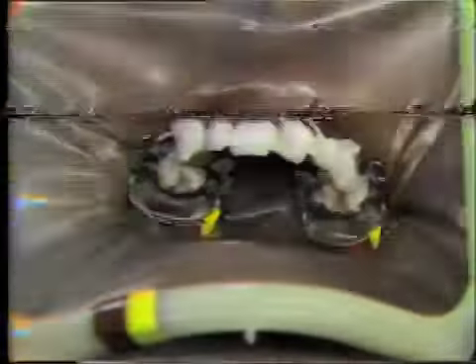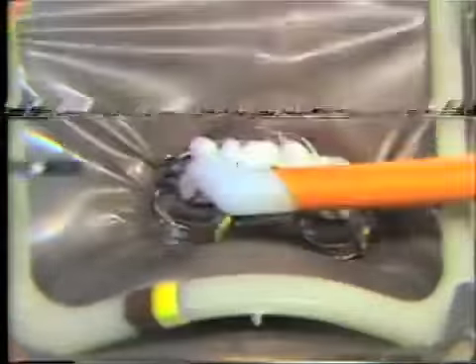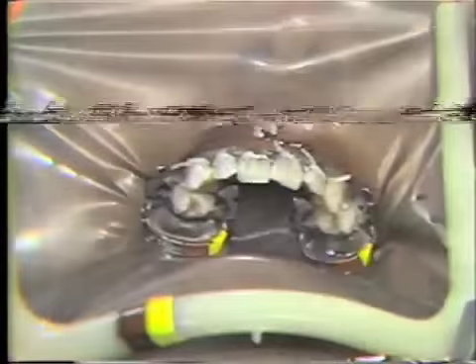We've been working on Carolyn here for 20 minutes. We limit our appointments to 20 minutes each time. Now, what I'm going to do is get rid of all the cotton, flush off the teeth, and remove the rubber dam, and then we'll get a chance to see what kind of result we have today.